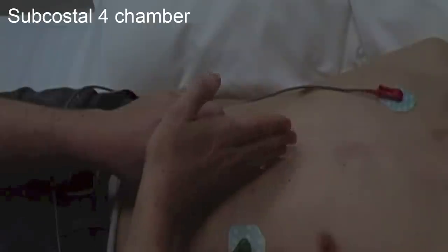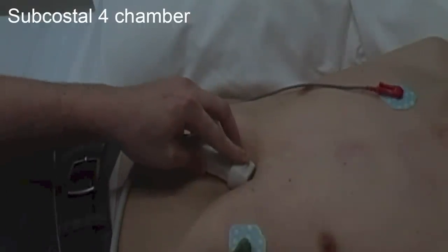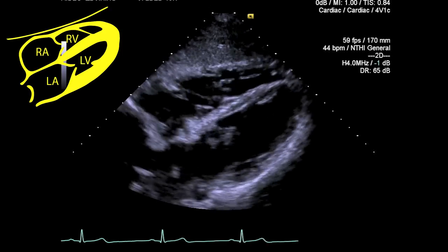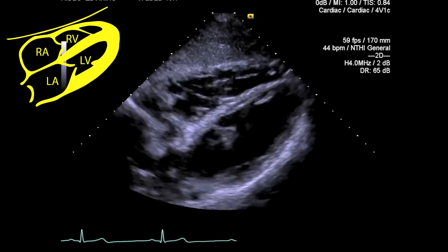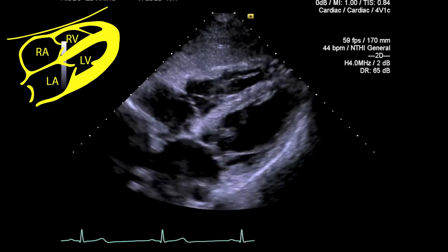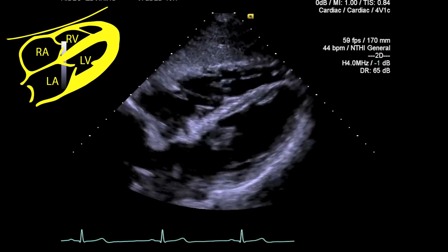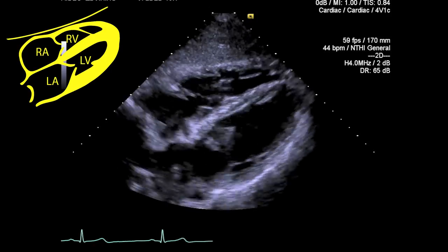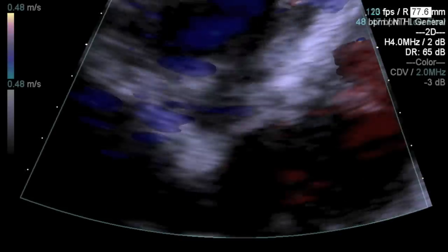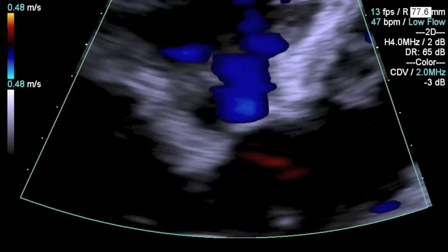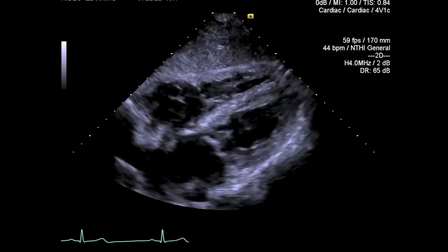Tilt the probe anteriorly and direct your ultrasound beam in between the suprasternal notch and the left clavicle. Assess this four chamber view, looking at the size of the atria and ventricles, and look for any gross valvular pathology or regional wall motion abnormality. Particularly focus on the interatrial septum, as it is now perpendicular to the ultrasound beam — any PFO or ASD will be visible by applying colour flow Doppler, as the flow between the atria is now parallel to the ultrasound beam. This is also often a simple view to exclude a pericardial effusion.